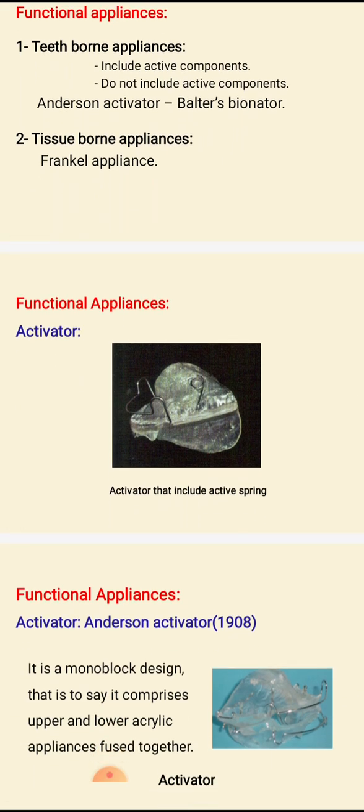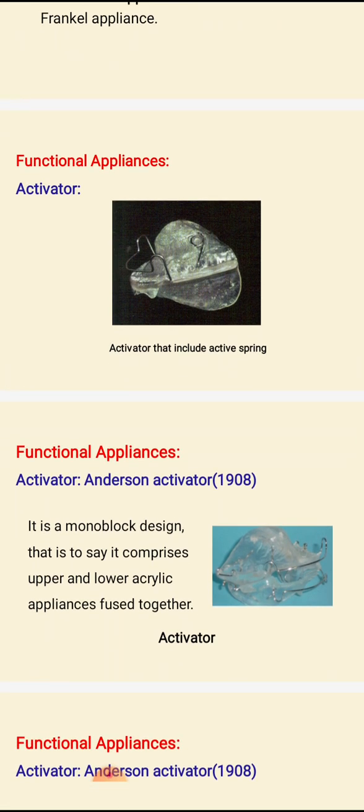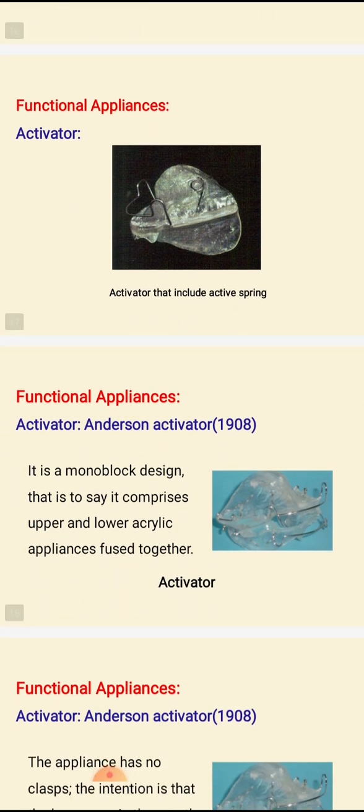Now we will discuss some of the common functional appliances used in orthodontics. The first one is the activator. The first activator was designed by Andresen in 1908. It can be described as upper and lower acrylic appliances fused together, and this design is called a monoblock design.